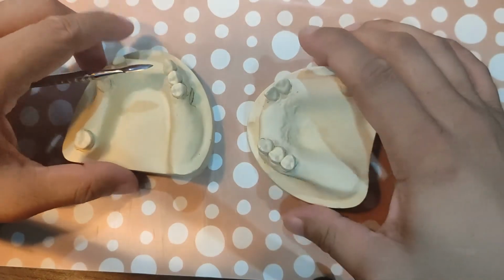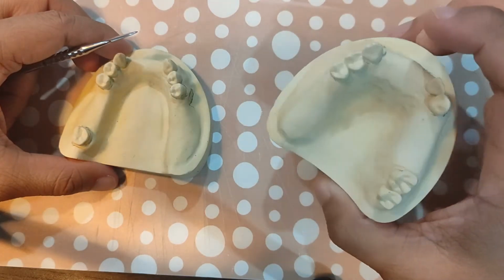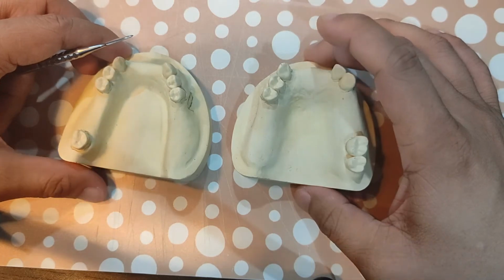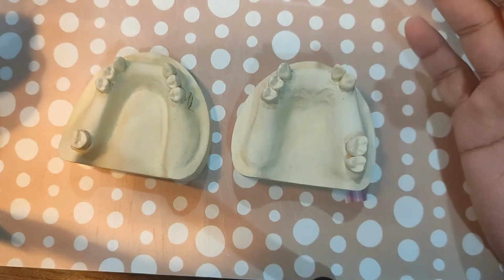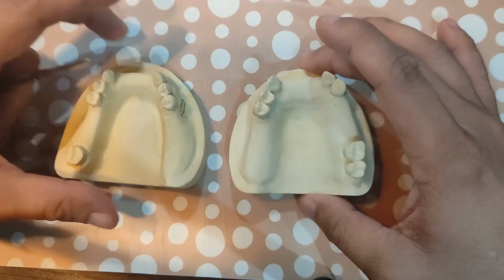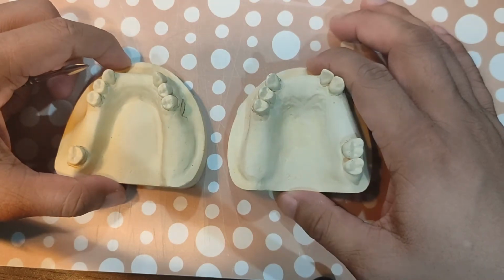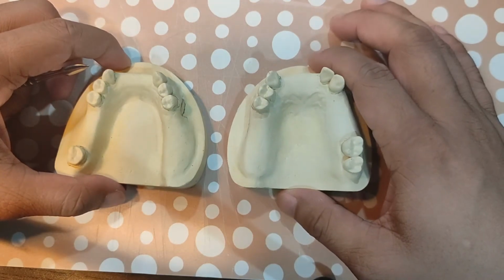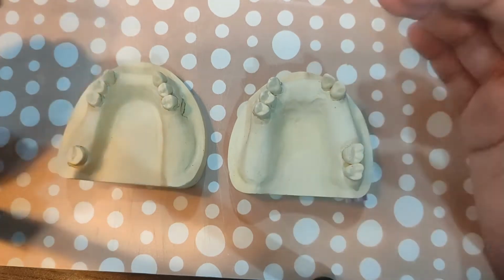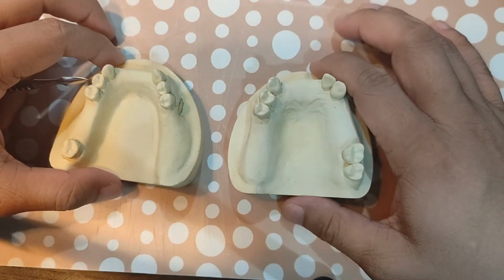Alright, hello everybody. So for this demo, we will be showing you how to do cast preparations. As I've mentioned before, our cast preparations are divided into two. The first one, we will need to simulate the mouth preps that are done to the patient. And the second one is the actual cast preparation where we do blockouts, relief, and beading.